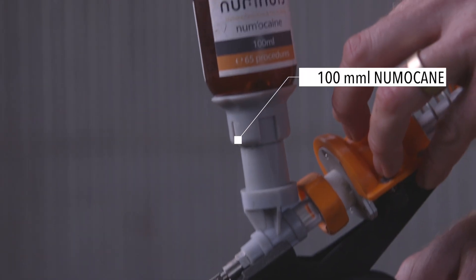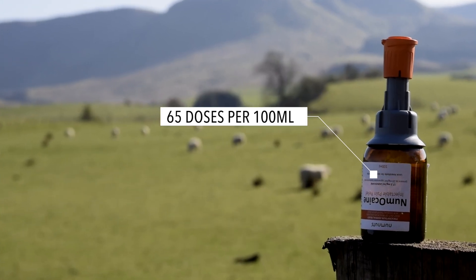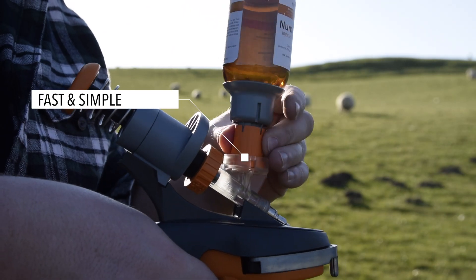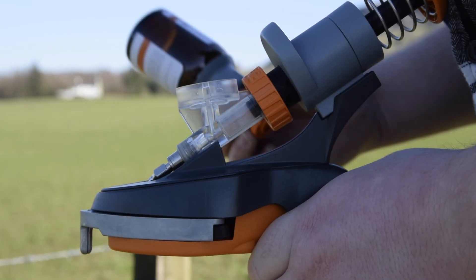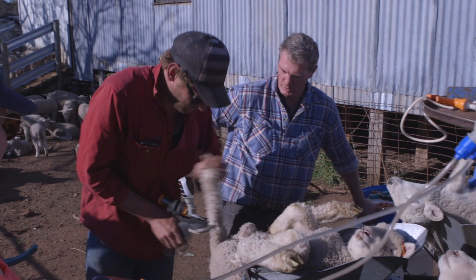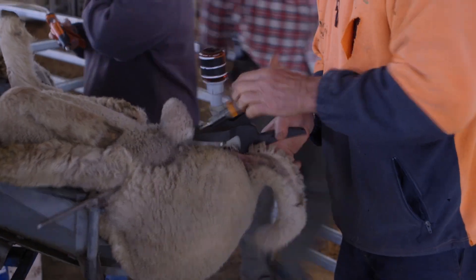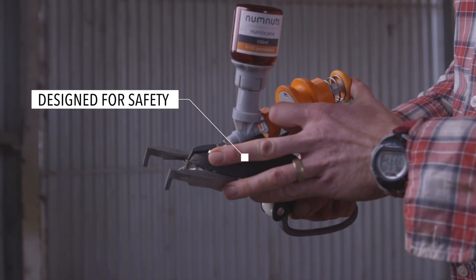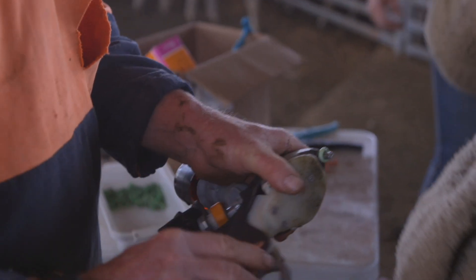The third part of the system is a quick-change cartridge. It's got 100ml of Numocaine local anaesthetic, which is good for about 65 doses. When the bottle is finished, it's just a case of twisting one off, putting a new one on, and you're ready to go again. It's fast, it's simple — it takes the hassle out of broaching bottles, and you and the lambs don't have draw-off tubes to get tangled up in. As an extra level of safety, the design of the cartridge also restricts access to the drug when it's not in use.